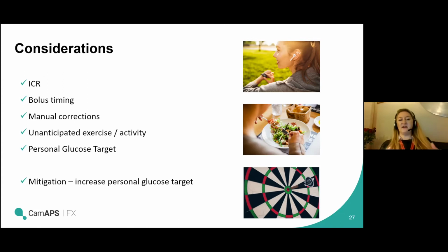Then gradually, after a couple of days, when you've worked out what needs to happen and adjusted the carb ratios, drop those glucose targets down again to something like a halfway house. That means the time in range is still good, but you're not having so many low excursions.